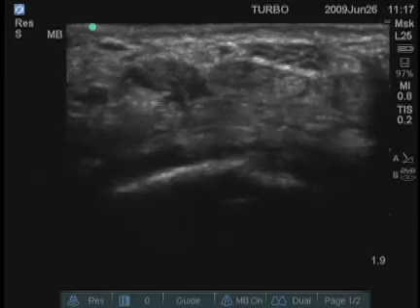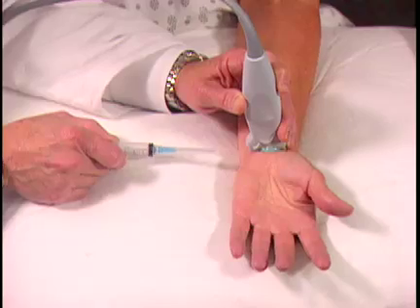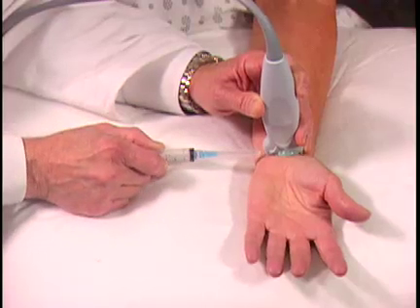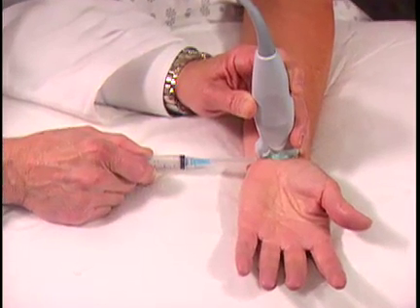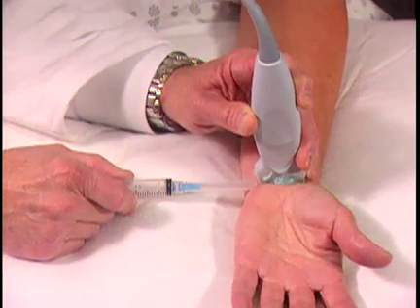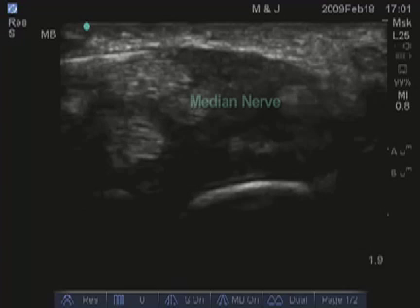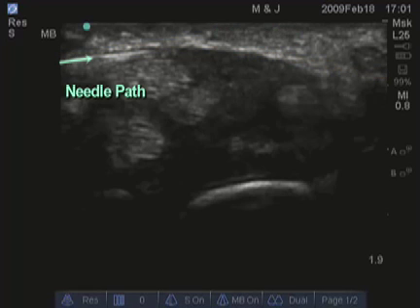I mark the ulnar artery with an indelible pen, and then move just a little bit to the radial side so that the ulnar artery is down here, and place a 25-gauge needle in this direction very superficially, because it's only 2 millimeters deep, and bring that needle in from the left side of the screen. The median nerve is sitting right here. The retinaculum is along this surface here, and the needle is coming in from the left side of the screen.